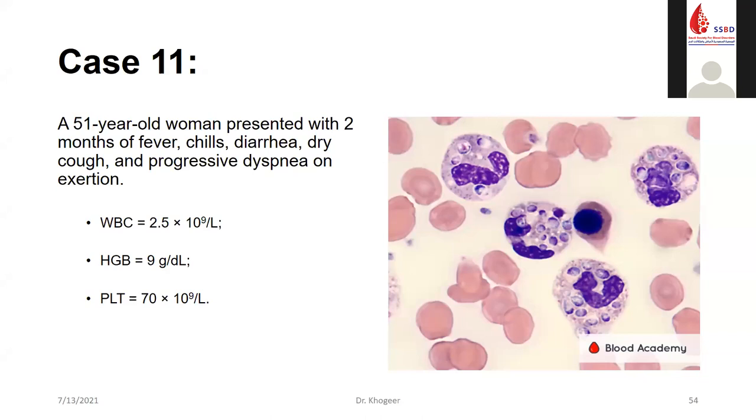Okay. Some question I couldn't understand what exactly you mean, but let me go through another question. So, what is the difference between reactive lymphocyte and atypical lymphocyte? In the older days, the word reactive was similar to atypical, especially in the hematological field. But atypical in anatomical pathology is more likely to mean abnormal or neoplastic. But in hematology, atypical is more likely to be reactive.